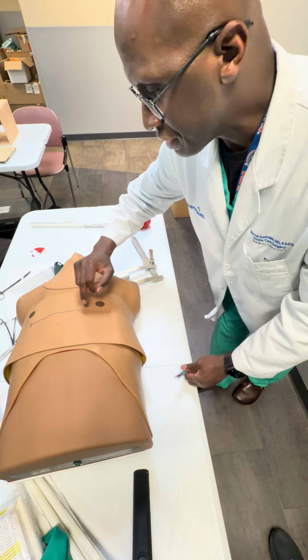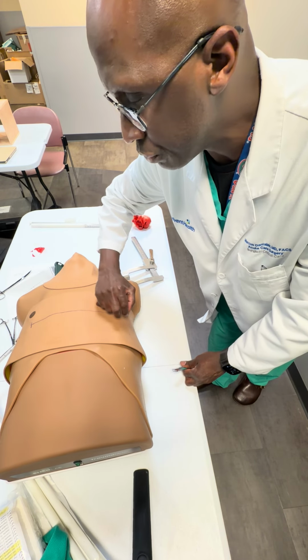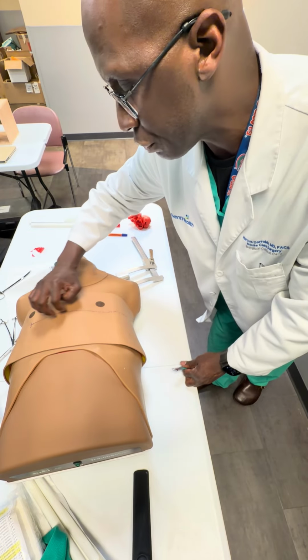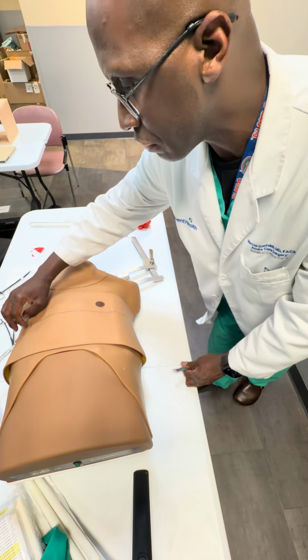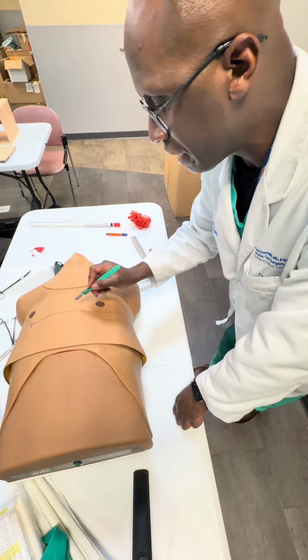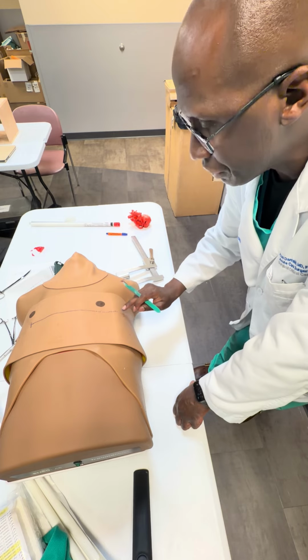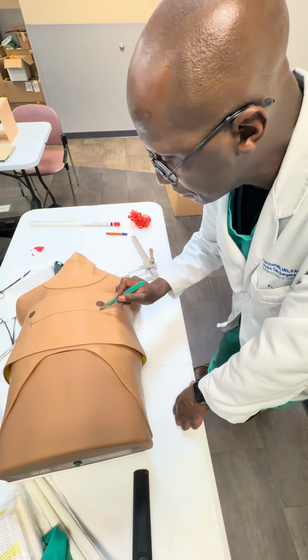You can also extend that line to the contralateral nipple space in case you want to convert that to a clamshell. So you have that line already here. In some instances, you can actually start here, but actually get into the thoracic cavity with your anterior lateral thoracotomy.